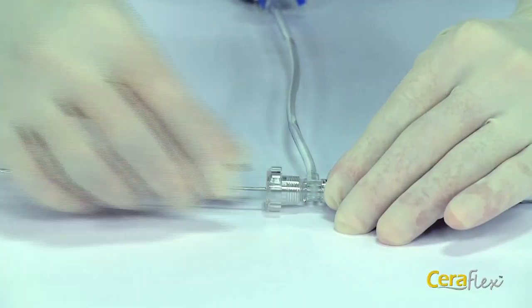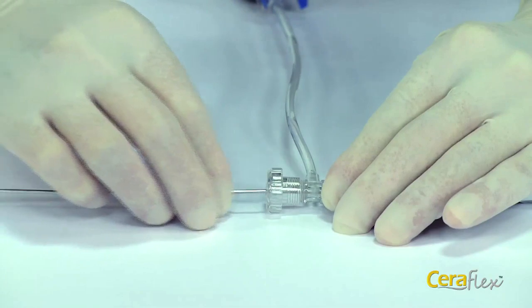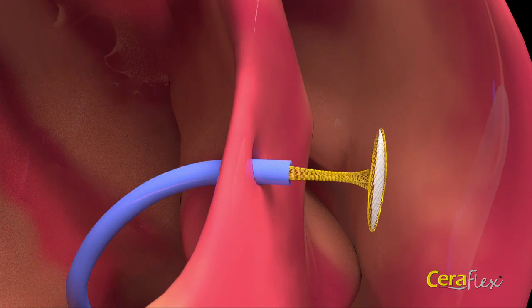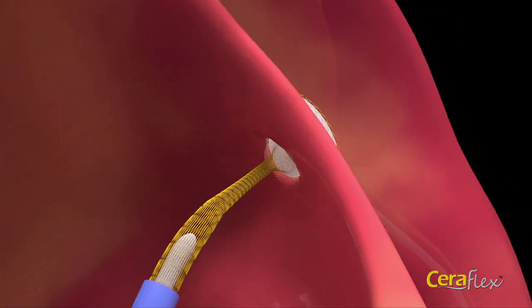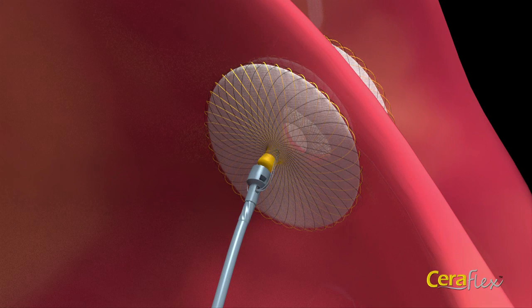Gently loosen the hemostatic valve and advance the delivery cable. When the occluder arrives at the defect, open the left atrial disc and waist in the left atrium and gently pull the device against the atrial septum. Then withdraw or pull the sheath back to deploy the right atrial disc. Ensure the device is placed properly. Finally, proper device placement must be confirmed with fluoroscopy and transesophageal echocardiography.